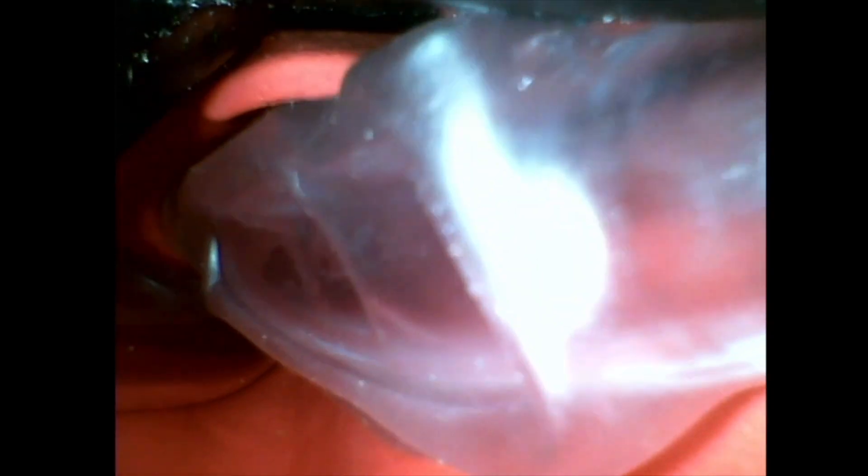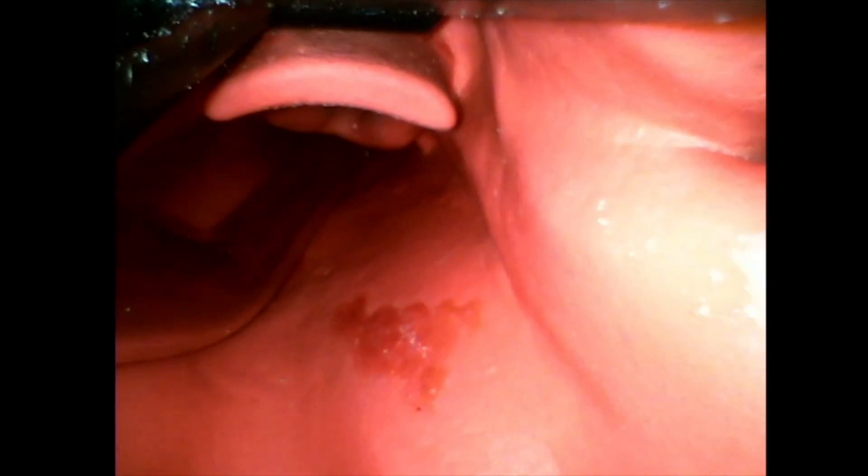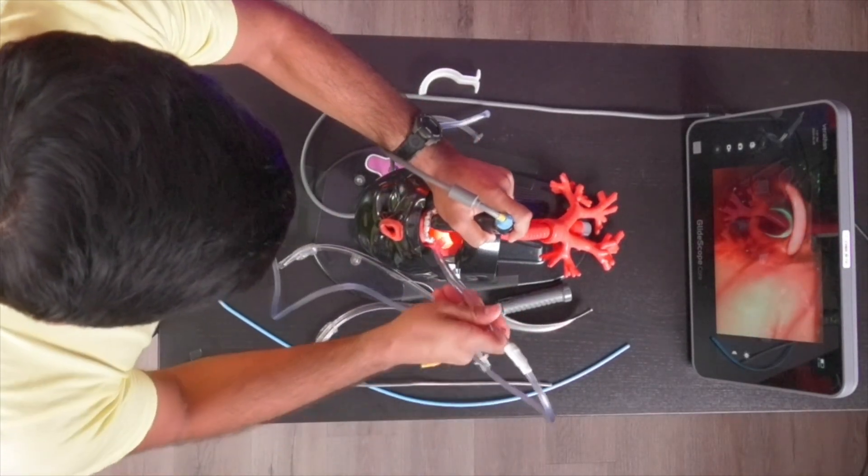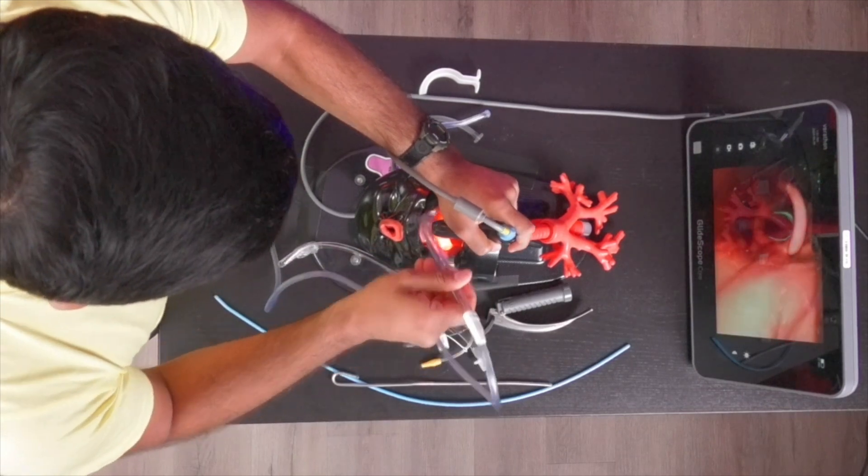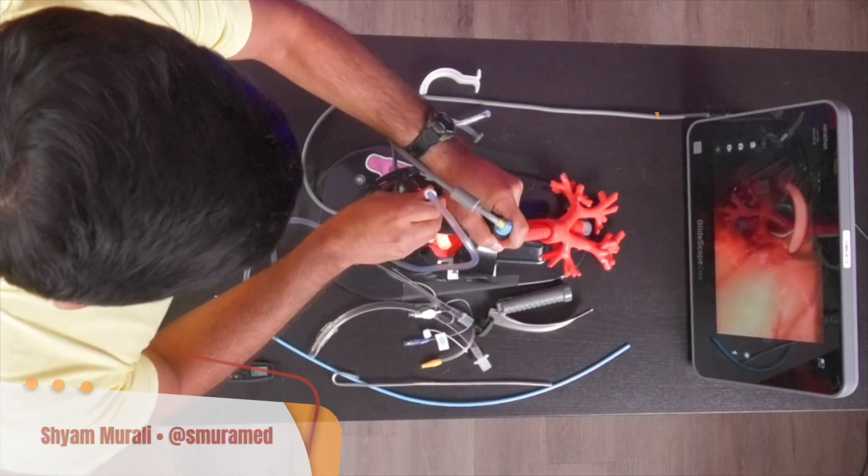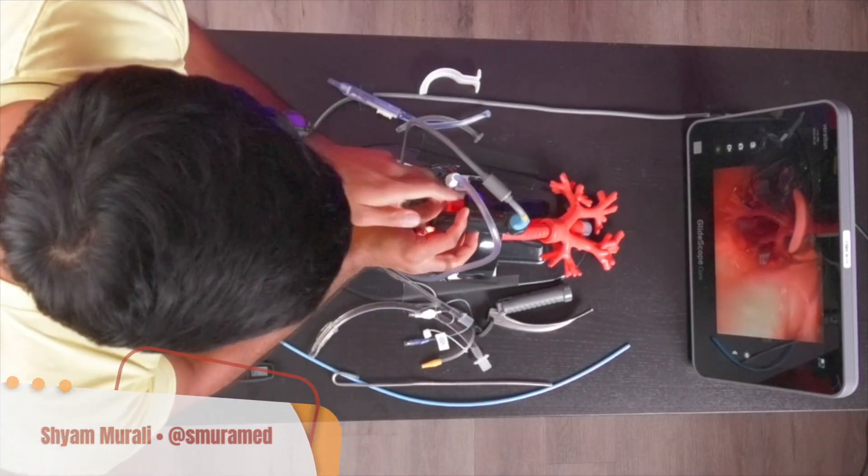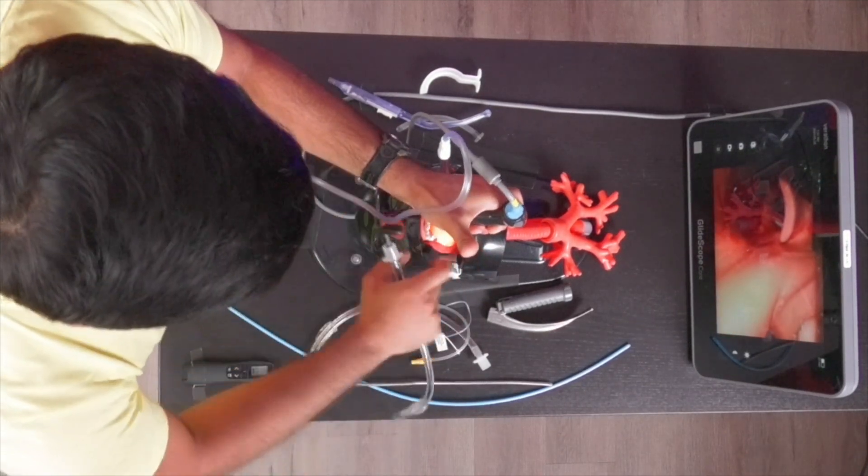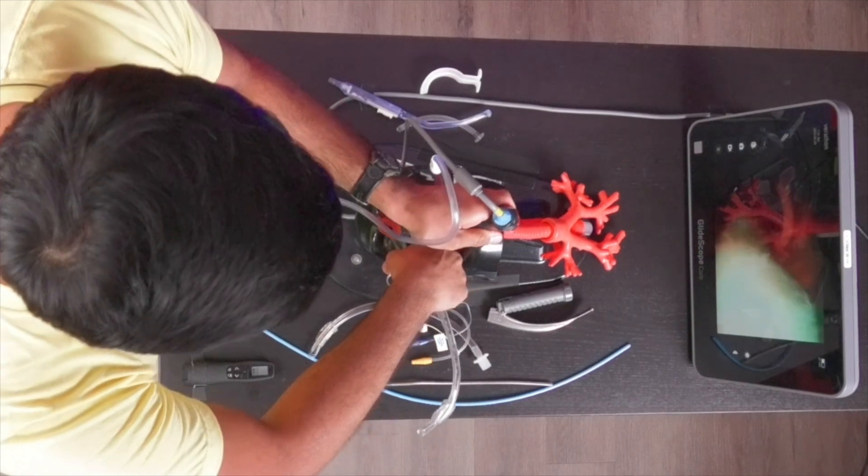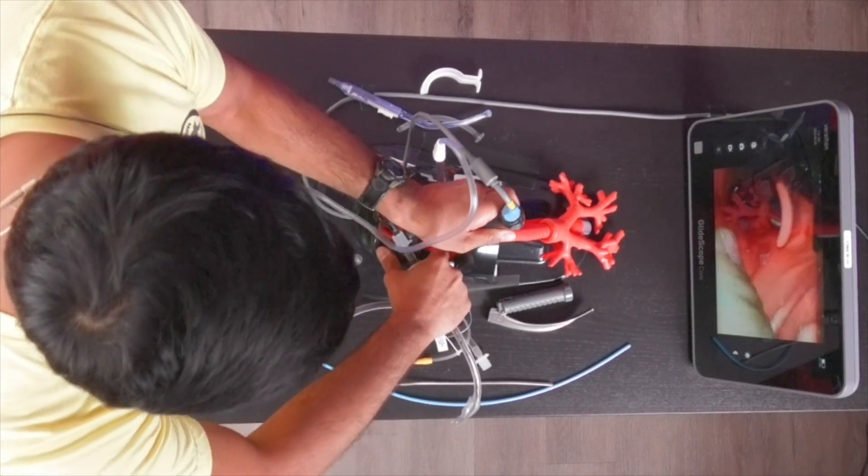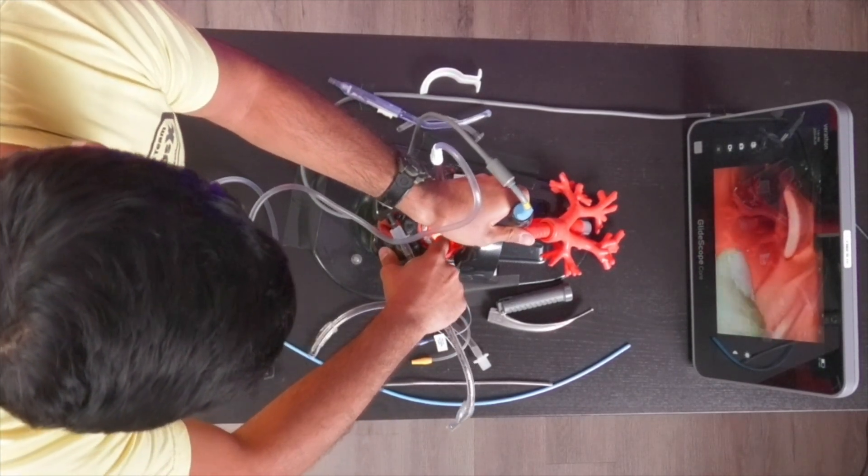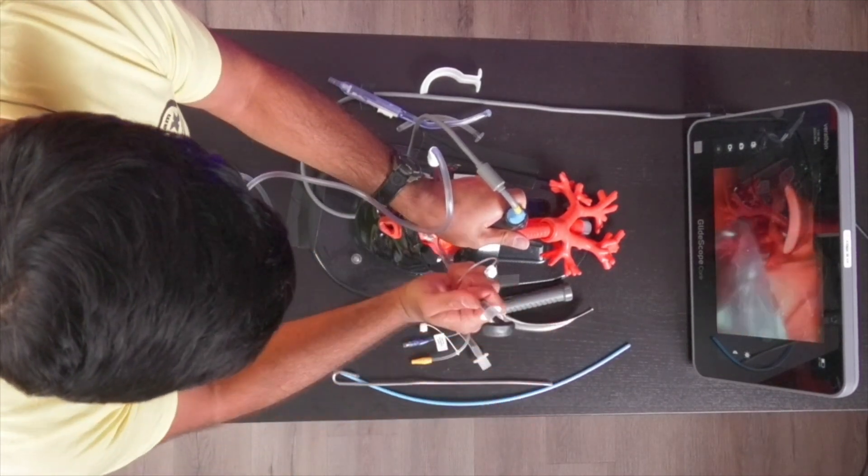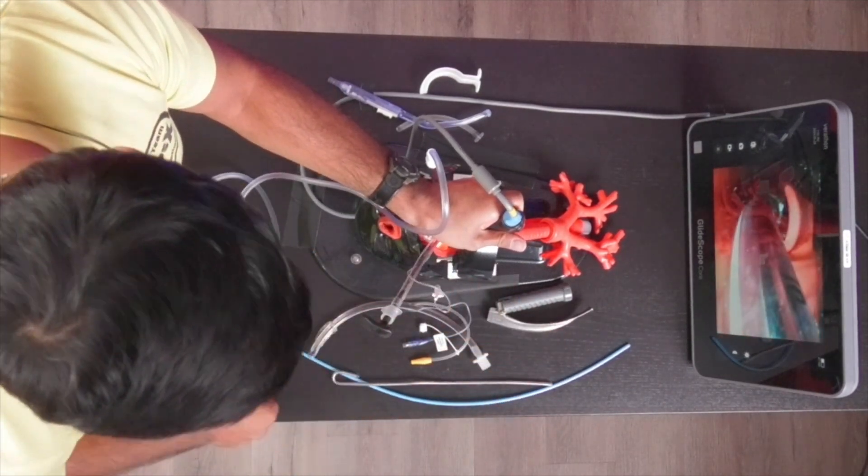I'm going to pause and go back a little bit. Let's get the overhead cameras one more time. Just to review, you've got your suction park method bringing it to the left side, and you may need to readjust your grip. Then the SALAD poke method, where you put your finger into the mouth to dilate out this space. This allows you to shift your blade over to the left by holding all those tissues, then you can bring in your endotracheal tube for intubation.